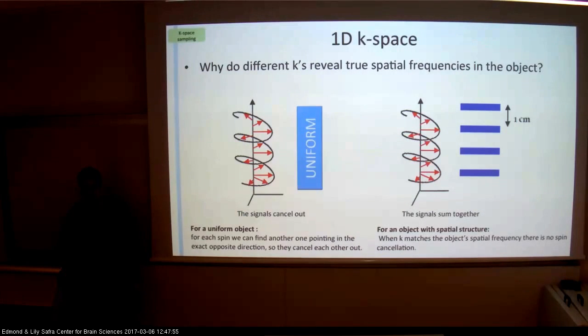So one excitation gives you all the frequencies? Yeah, we're going to see that. It depends on the way we're running it within K space. In the simple version, it will give us a line in K space. And there will be ways maybe to run between lines in K space. I'm going to show it in a second.